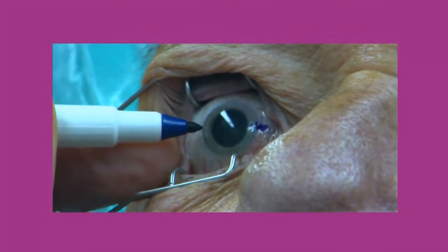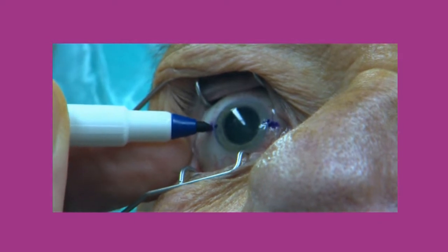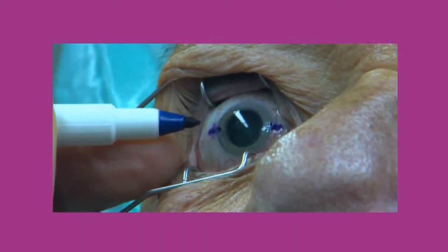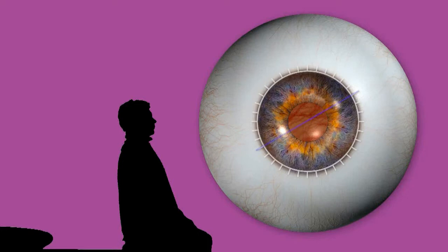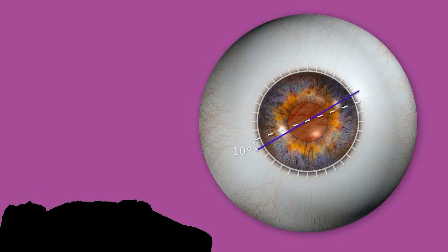To ensure the biflex toric IOL is properly positioned along the right axis, the 0 degree and 180 degree meridians of the cornea should be marked prior to surgery as references. Upright positioning of the patient is necessary for the marking, as the natural rotation of the eye when the patient is inclined is about 10 degrees.